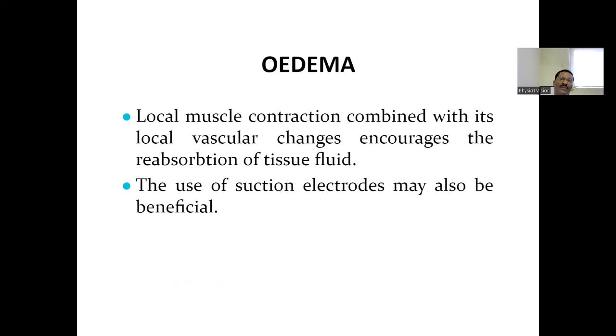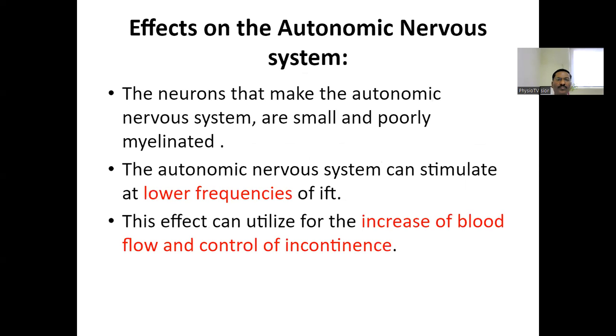The next physiological effect is on edema. In edema, the muscle contraction, which is combined with vascular changes, encourages the reabsorption of the tissue fluid. There is also one more additional effect of suction electrodes.